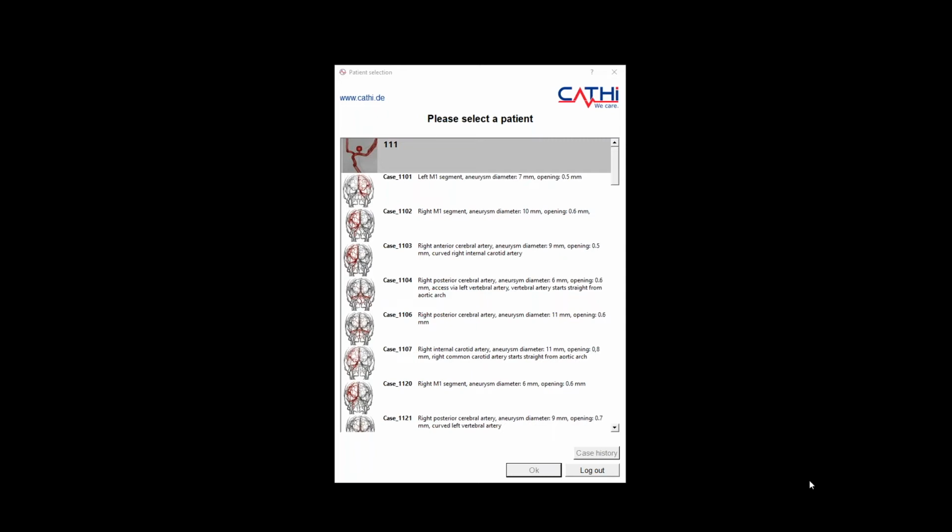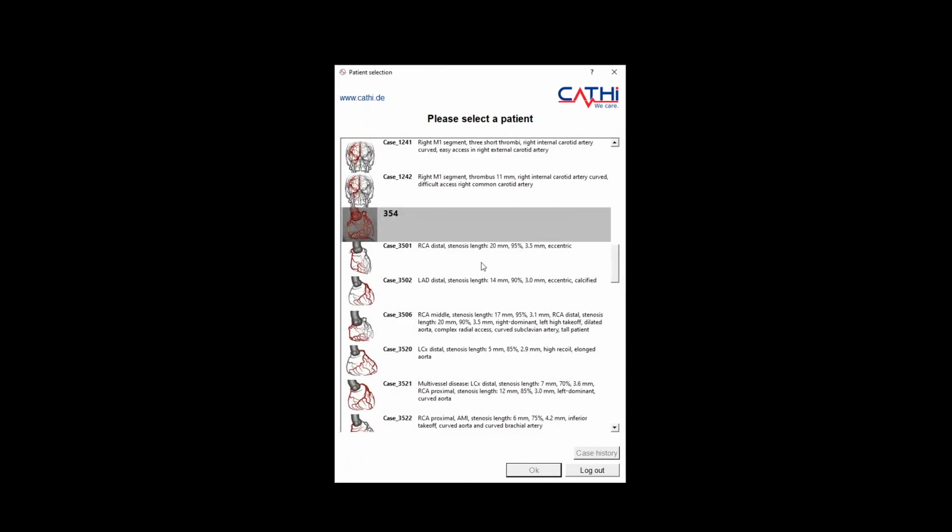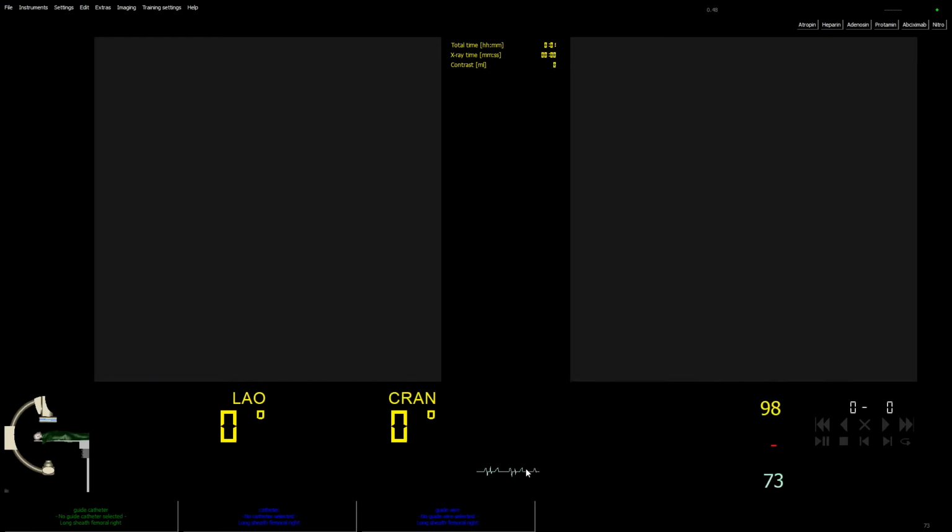Okay, now would you like to start now, Ahmed, from here? Now here you can see we have a library of modules or cases. Our case today is the PCI again. So once we choose it, Ahmed. It's just loading the case now. Just take into consideration that because of the streaming, it might take a couple of seconds of delay. But in real life, it's nothing like this.